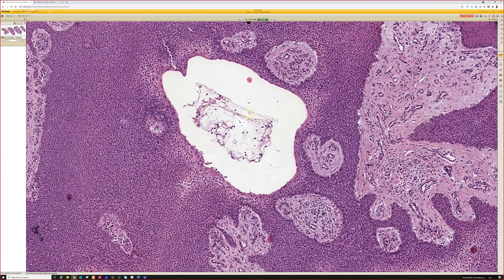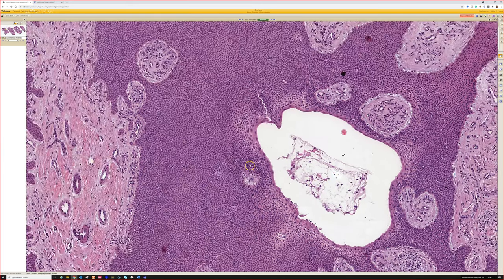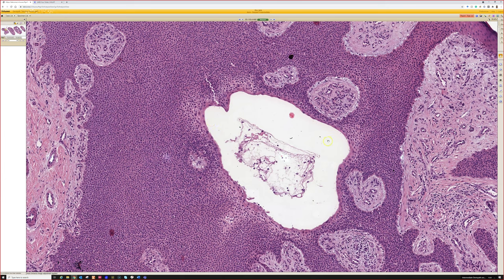One problem I have is that poromas look a lot like seborrheic keratosis sometimes, and I always am looking for zebras, so sometimes I'll be like, oh, I think it's a poroma. Especially in residency, I'd do this, and then it was just a seb. And also sometimes I'll see spaces like this in a lesion and think, oh, is it going to be poroma? And then they're just dilated, kind of keratin-filled spaces. So sometimes it's hard to know if it's a true duct space.